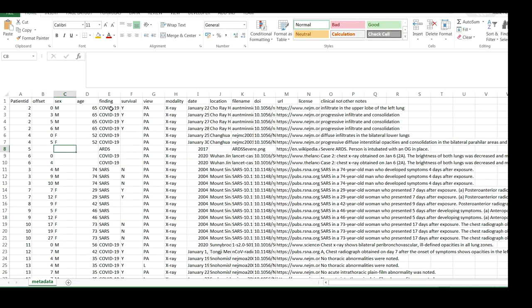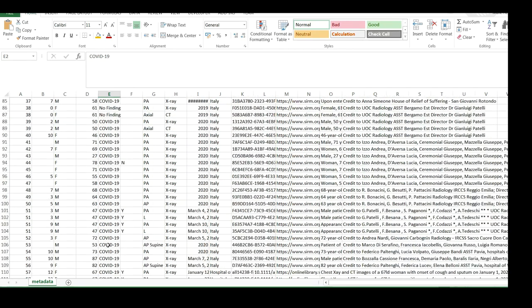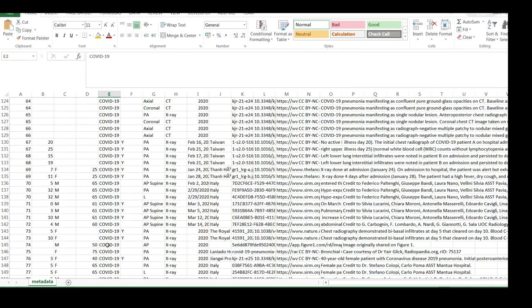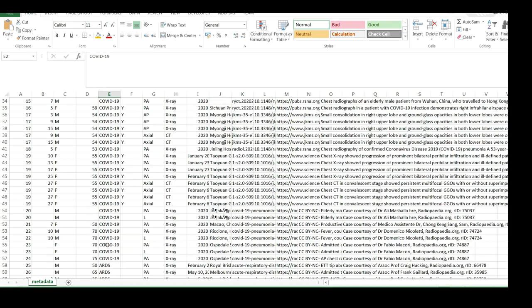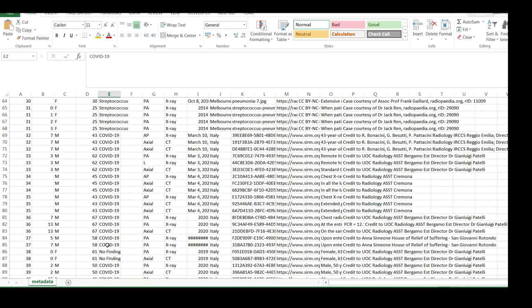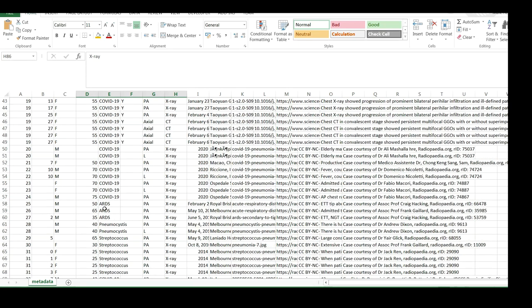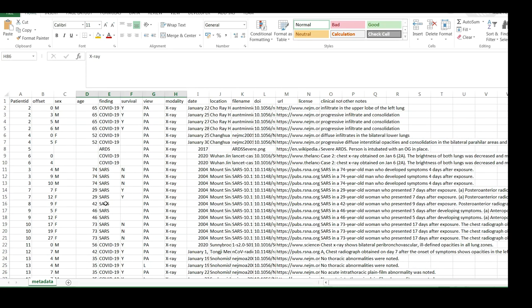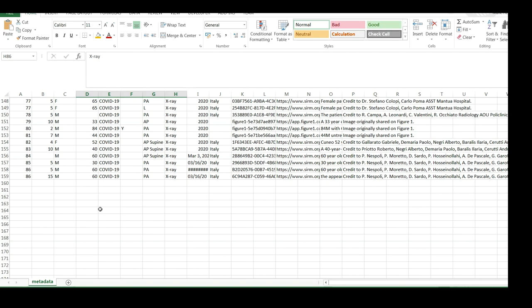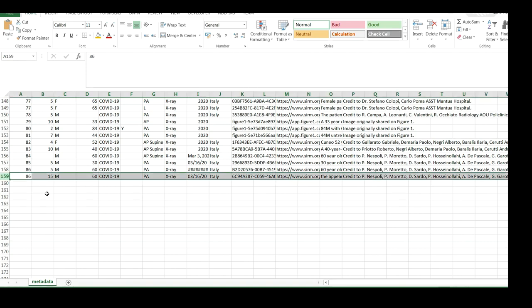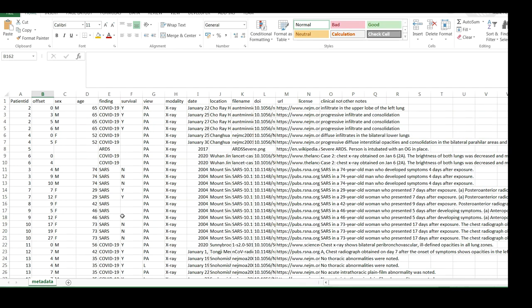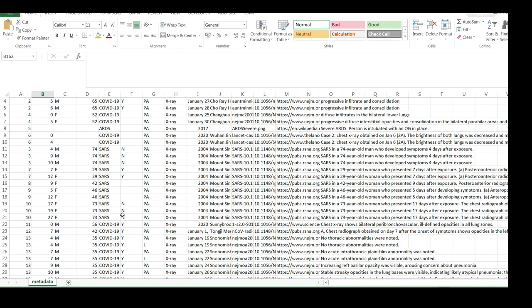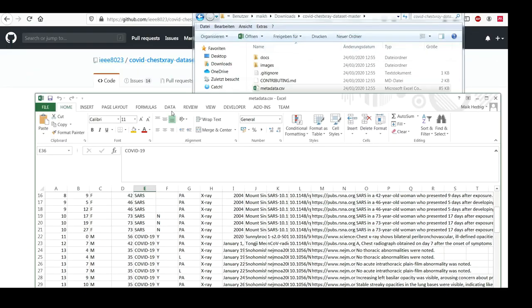First of all, I can see that most of the images in this dataset belong to COVID-19 cases, and there are actually only two images which refer to a healthy patient. Therefore we are facing several problems. First of all, the dataset is relatively small considering the complexity of the problem we would like to analyze. Next, it is highly unbalanced, so we have much more COVID-19 images than healthy images.